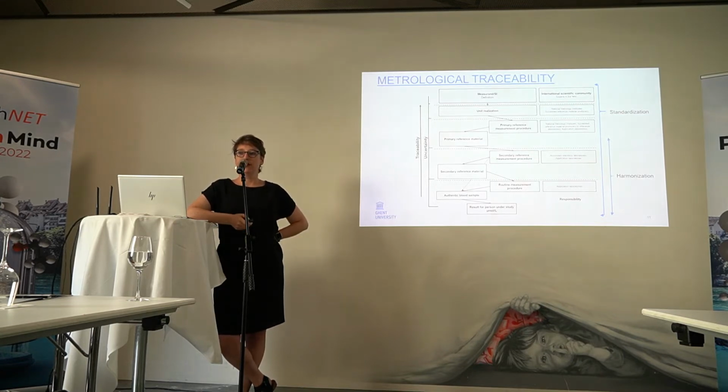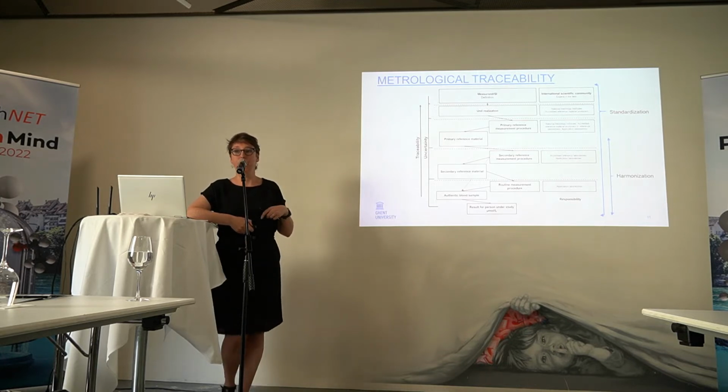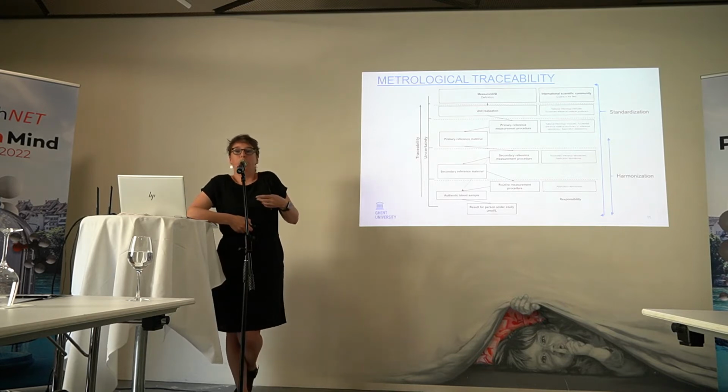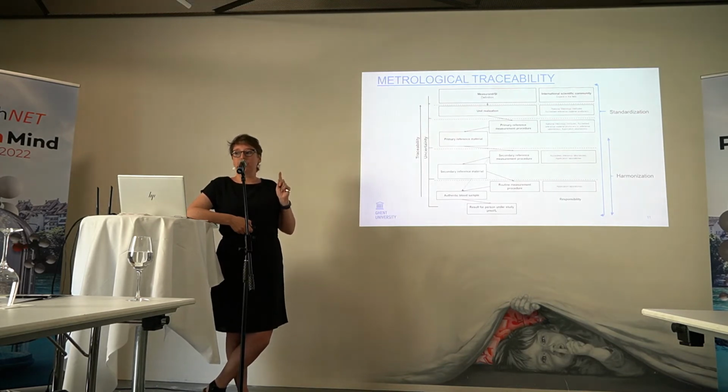That's a very tricky one because the TSH exists in many different forms because of post-translational transformations. So it gets hooked up with all different kinds of small molecules, and there's not one single chemical structure which defines TSH.